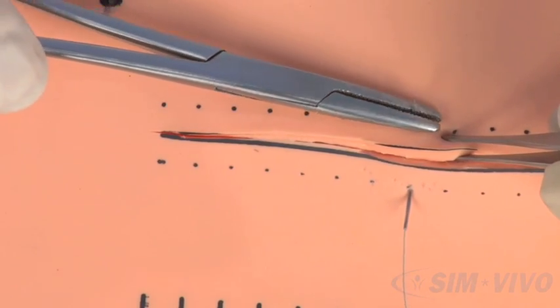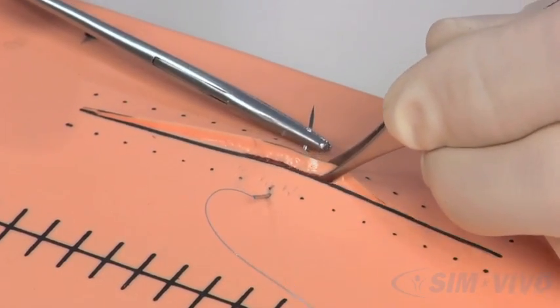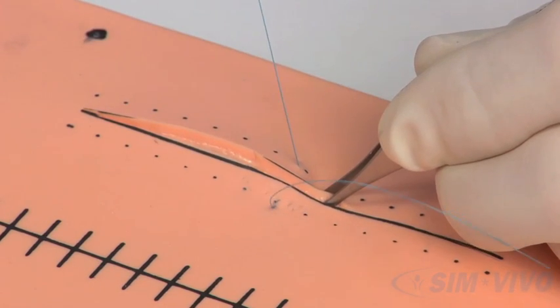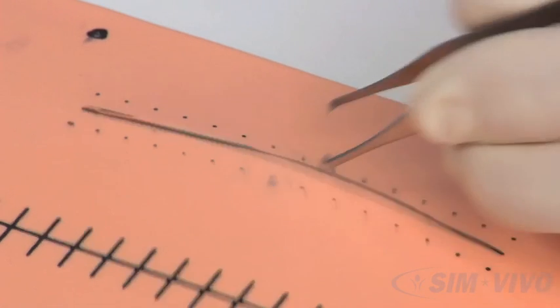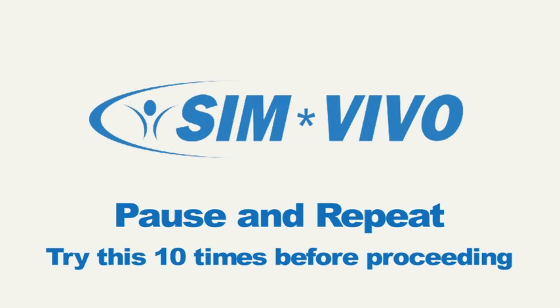Release the needle and grasp it. Notice that the skin has not been released with the Adson forceps. Now rotate the needle through and bring the suture completely through the skin. Great! Practice this 10 times. The next segment will demonstrate an instrument tie.